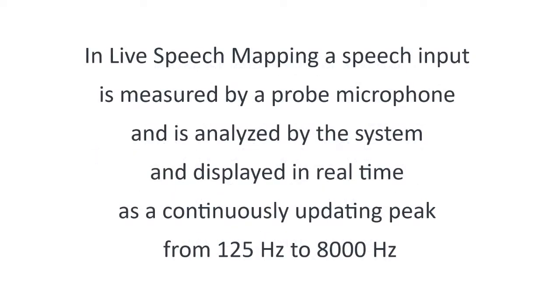In live speech mapping, a speech input is measured by a probe microphone and is analyzed by the system and displayed in real time as a continuously updating peak from 125 Hertz to 8,000 Hertz.